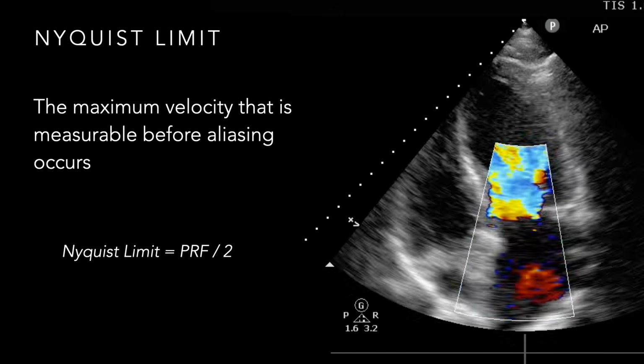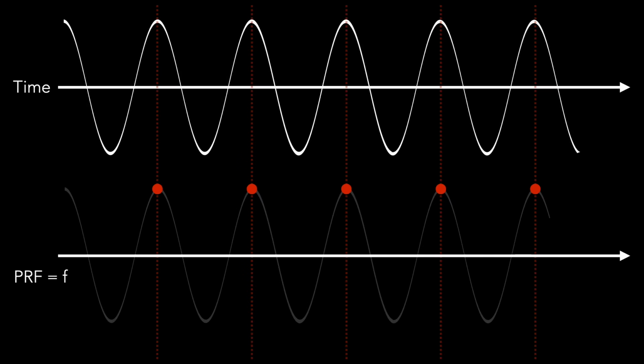I want to prove this to you in graphical form, right? So let's talk about this as a sine wave. We can look at this in different forms of objects that move, but in this context, I just want to use a sine wave because we can see this periodicity, this frequency, measured out over time. So our x-axis is our time, and we can see the undulation of the positive and negative deflections of the sine wave. So like I said, 1 cycle per second is represented here by those dashed lines. So I started at the top of the peak.